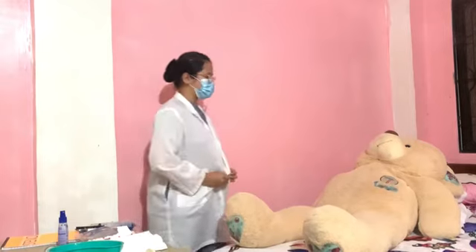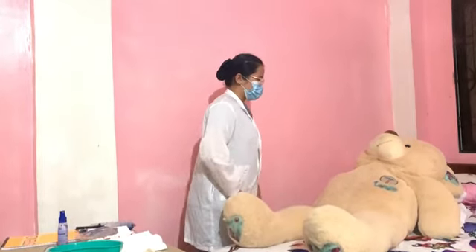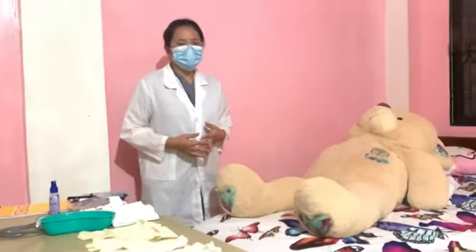And then next, identify the patient so that you will give nursing intervention to the right patient. Today, ma'am, I ask your name po. Thank you, Ms. Reyes. And then explain the procedure to the patient and explain the rationale why the tube is needed. Discuss the associated discomforts that may be experienced and possible interventions that may allay this discomfort. Answer any questions as needed.